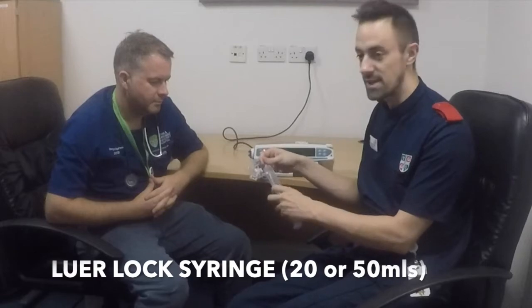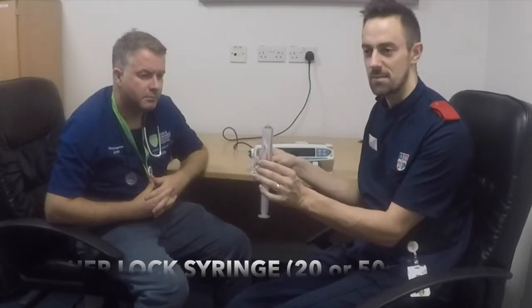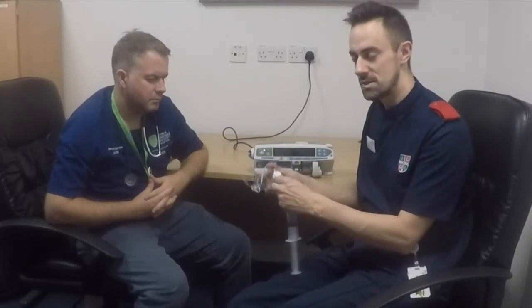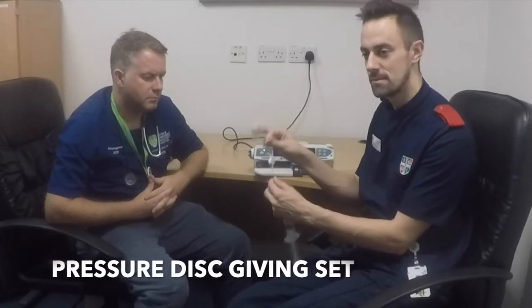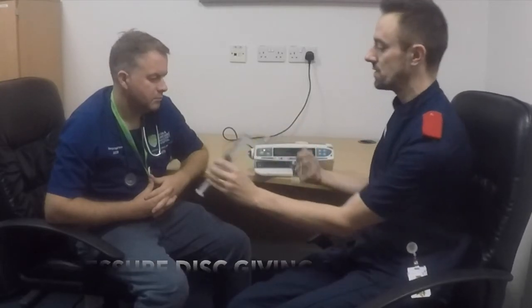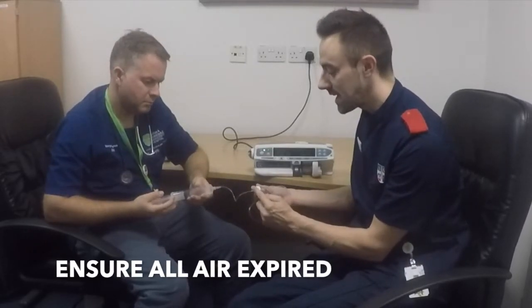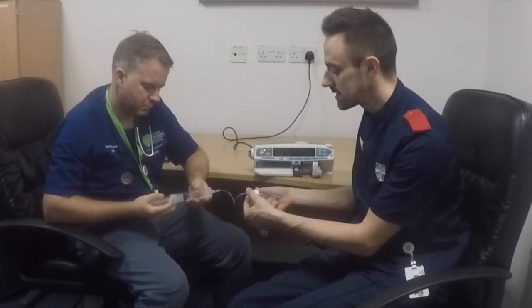First of all, you must ensure that you're using a lure lock syringe — that's a screw-type adapter. These devices are only licensed for lure lock. Secondly, you need a different giving set to that used on the adult pumps; you must have the pressure disc. As you push the fluid through, you need to ensure that you're not getting any air trapped in the pressure disc. To get rid of this, you can just massage the air bubble away.